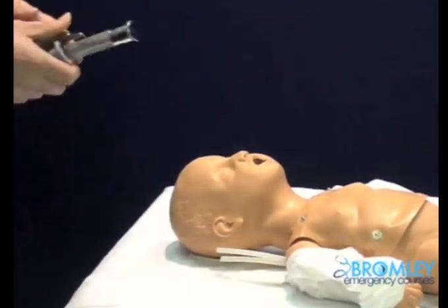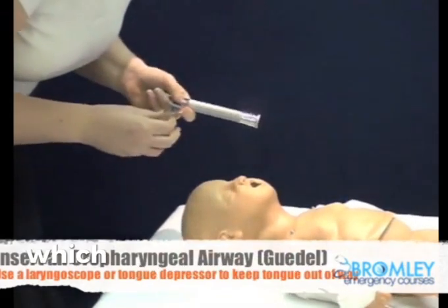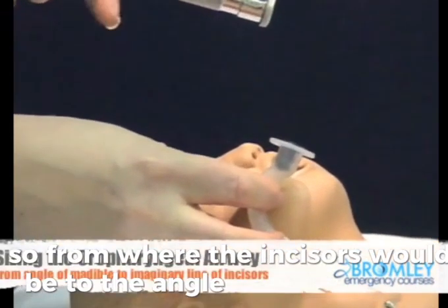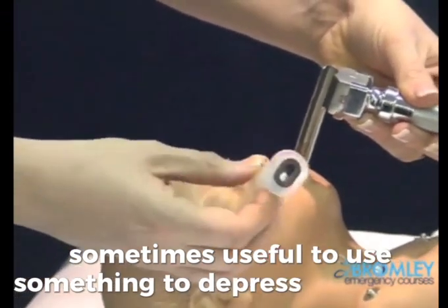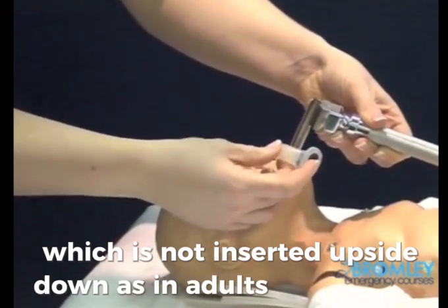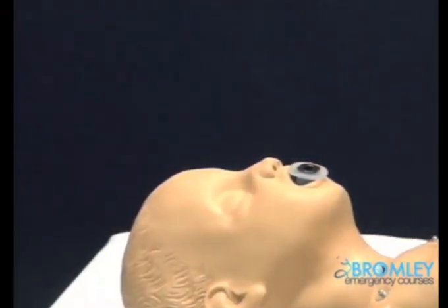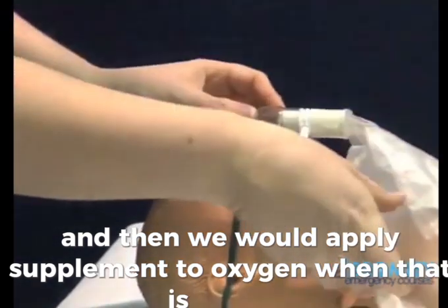A Guedel airway, which would be sized in a similar way to how we size it in adults, so from where the incisors would be to the angle of the mandible. Sometimes it is useful to use something to depress the tongue when inserting the Guedel, which is not inserted upside down as in adults, but forward. And then we would apply supplemental oxygen when that is in place.